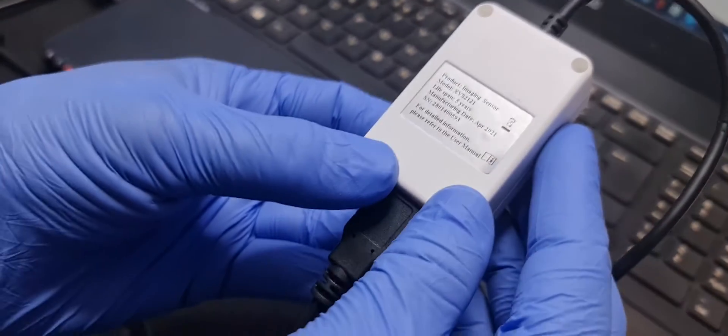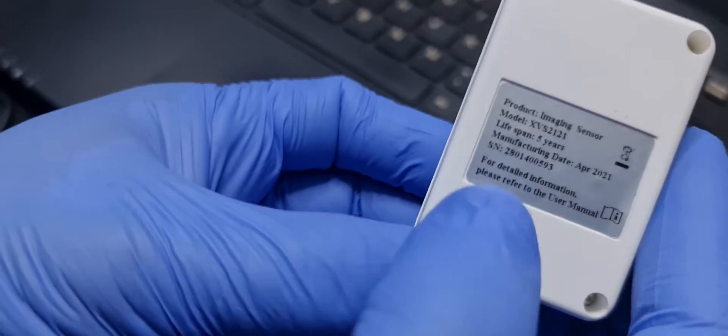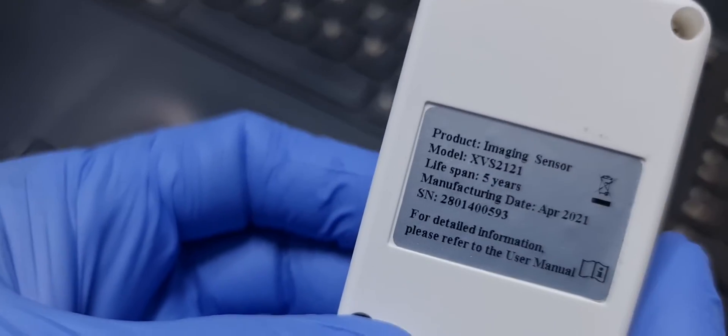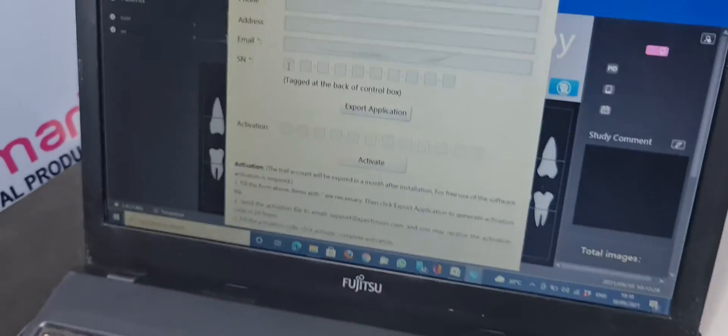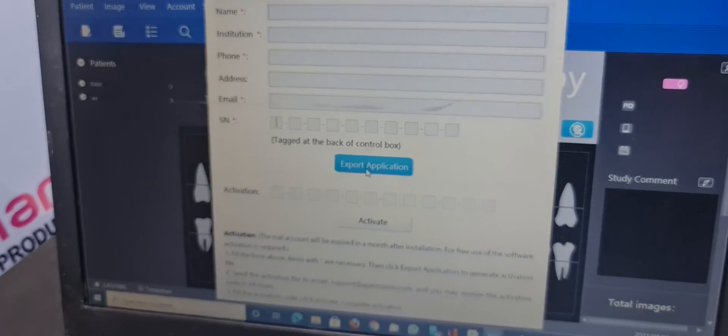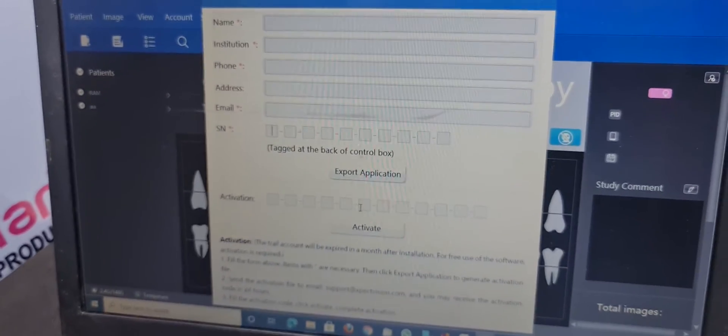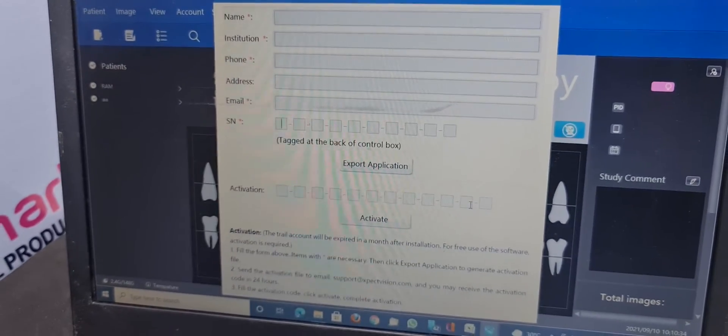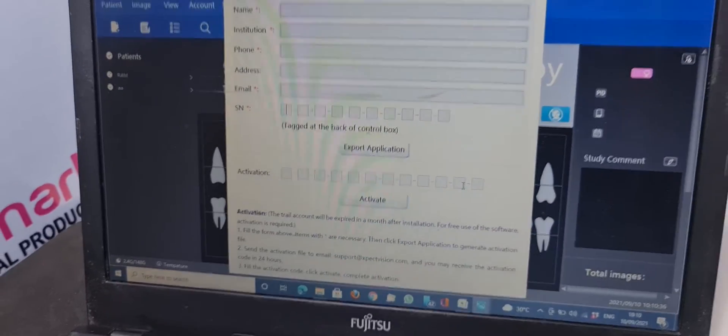So serial number is behind the sensor controller. You can see here is the serial number. You can add the serial number here, export application, later on you can activate this which application will be exported.